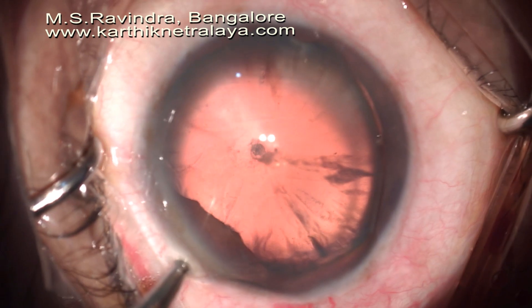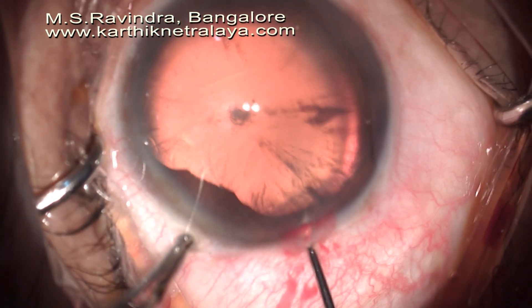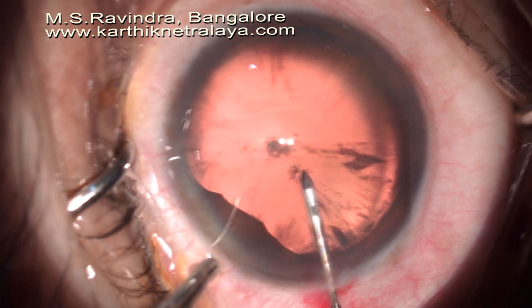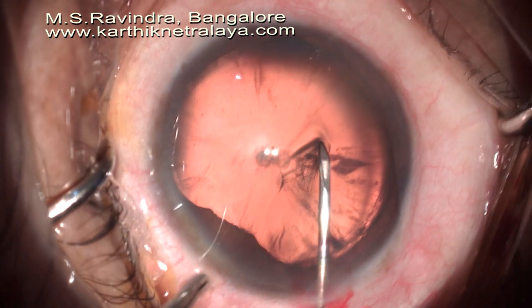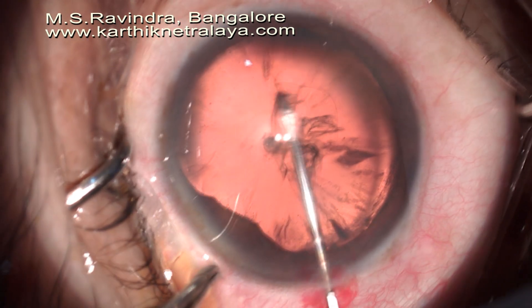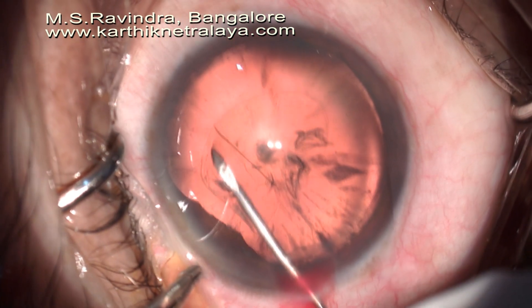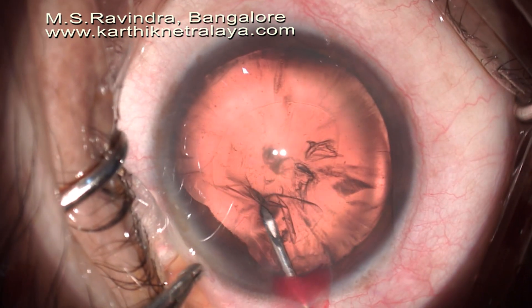Rhexis is done very carefully with the tunnel floor entry technique so that there is no loss of viscoelastic from the eye during this. The lens movement was present, which again indicated the loss of total zonular support to the lens margin. I predicted that the upper half of the zonules, where there is pseudoexfoliation, as well as the lower temporal quadrant, is probably dehiscent.